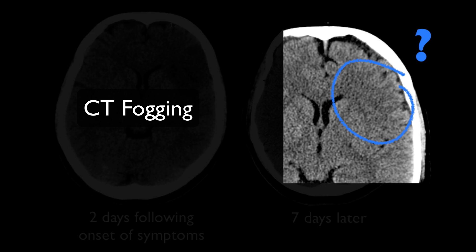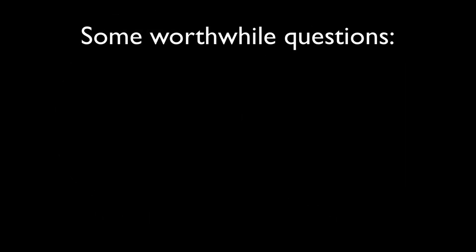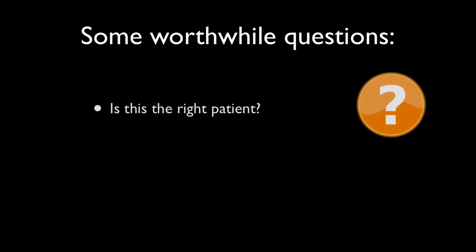Despite this, the patient had not improved. This is a typical timing and appearance of CT fogging. When one sees it, however, it's worthwhile asking a couple of questions. Firstly, is this the right patient? After all, if you were to accidentally scan the wrong patient, then of course it would appear that they had not had an infarct. Another worthwhile question is: are the dates correct? If there has been a much longer delay, or if you're looking at a CT obtained earlier than the stroke, then the appearances would be normal.